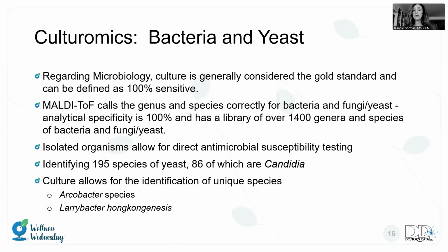Culture also allows for the identification of unique species. And it's interesting that Doctor's Data was actually successful in identifying a brand new species several years ago called Laribacter hongkongensis.